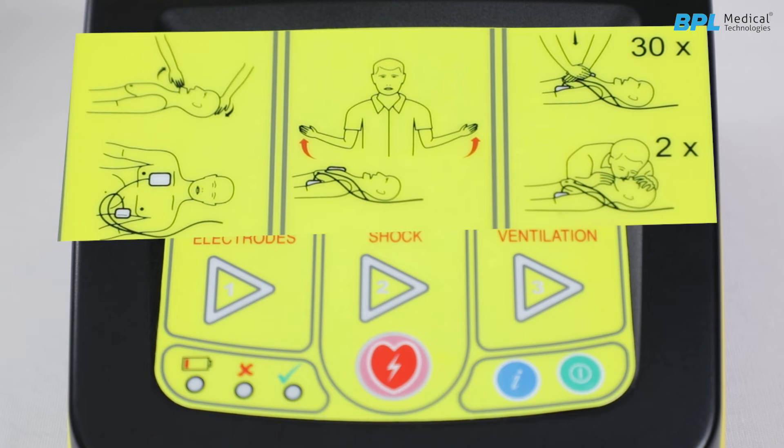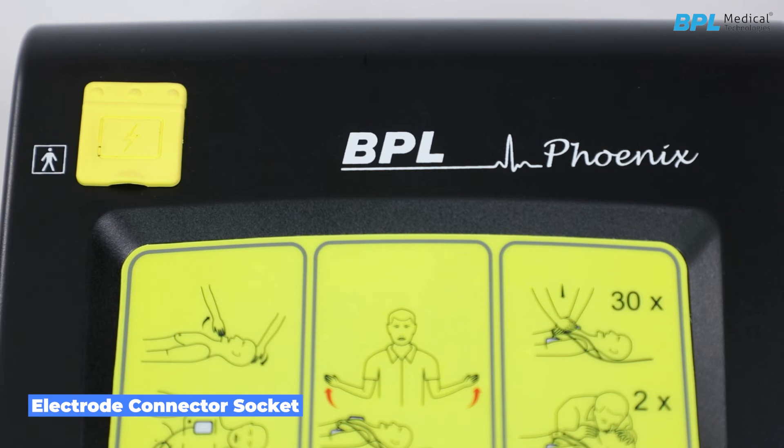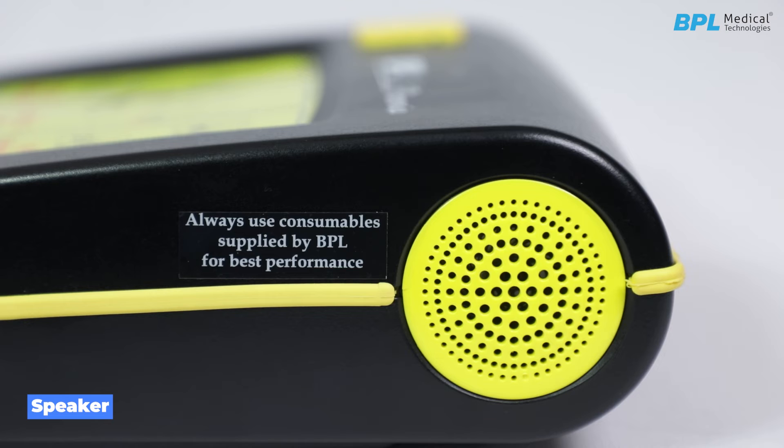Pictorial representation: to help the user clearly understand the sequential workflow stages, there are three pictorial representations on the front panel. Electrode connector socket with a rubber flap: this rubber flap on the left corner of the front panel covers the electrode connector used for plugging in the disposable electrode. The flap has to be flipped open only to insert the electrode connector into the socket during use. On both sides of the device is a speaker for audible signals and voice prompts.